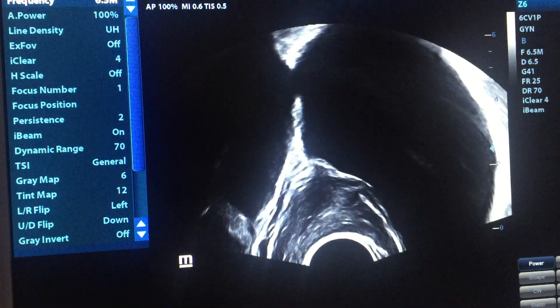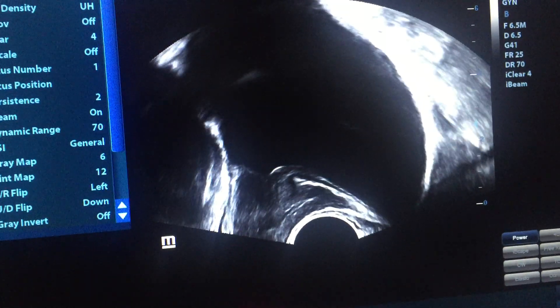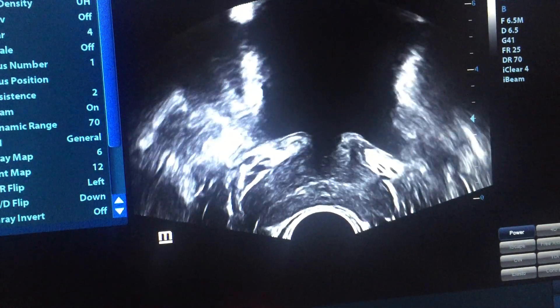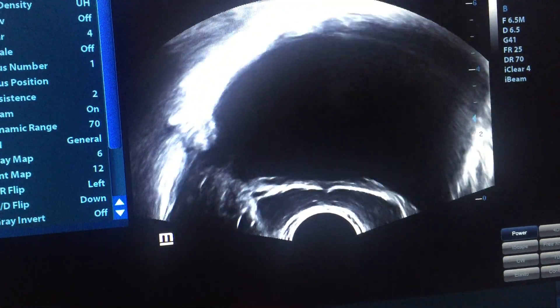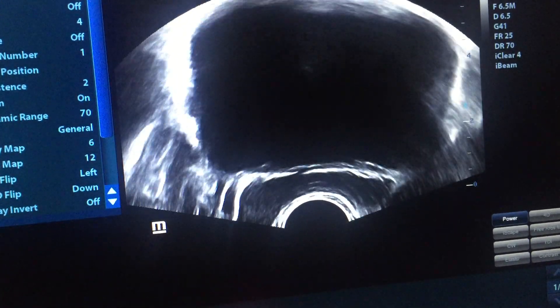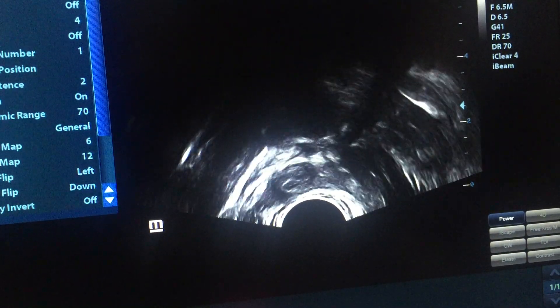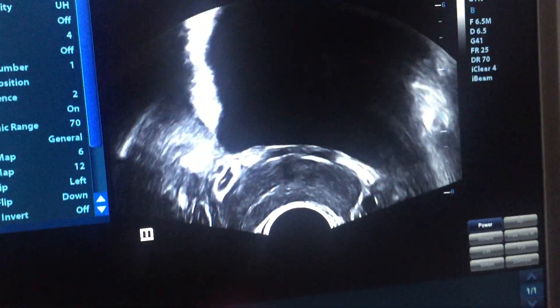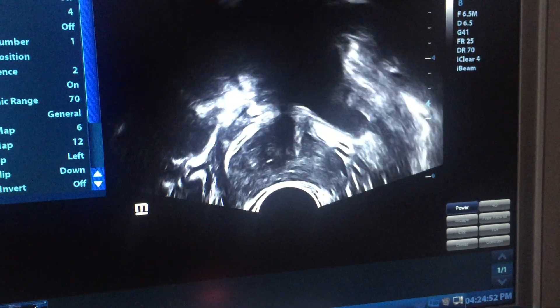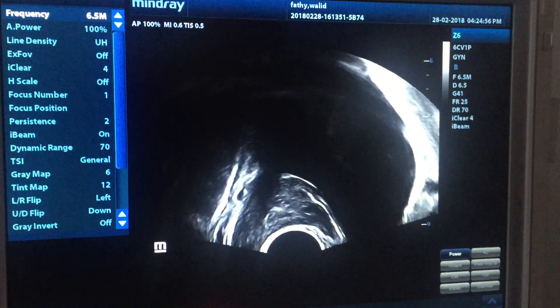Again, to check the sagittal scan from the right side to the left side — do it again. This is from the right side. Go transverse, go downward, then upward. By this method you perform scanning all over the prostate. Now make it longitudinal and we will finish.